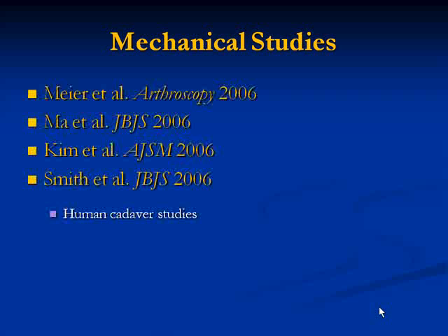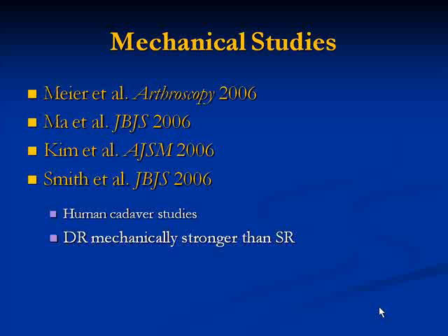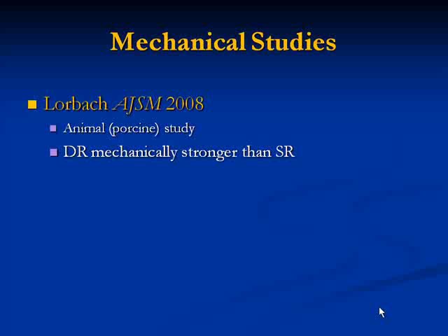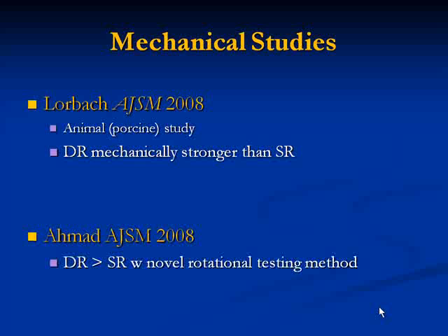And looking at the mechanical studies, there have been a number of studies, including from our center, Ma, Kim, Smith, on cadaveric specimens using different cyclic loading protocols, showing that double row is mechanically much stronger than single row techniques. Lorbach in 2008 did a porcine study showing double row stronger than single row. Ahmad in 2008 also used a novel rotational testing method, a slightly different way of cyclic loading, to also show double row being stronger than single row.